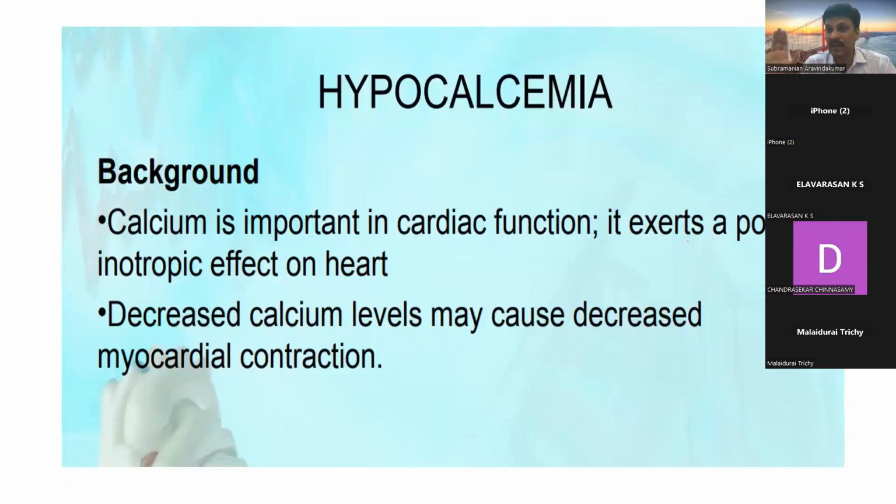You come across this very rarely. It usually comes in with the endocrinologist, where you commonly see this type of ECG, and they refer to us for this short QT. The next abnormality is hypocalcemia.